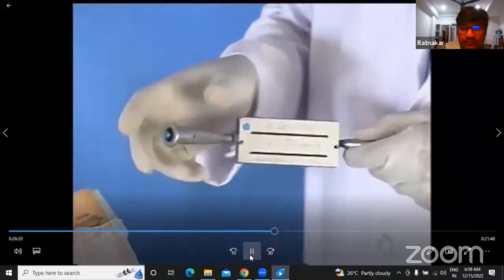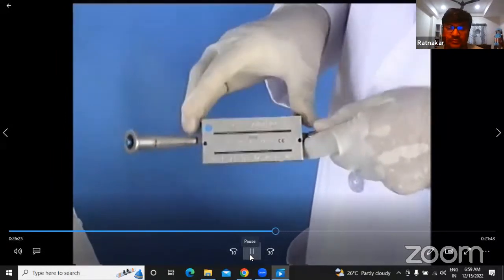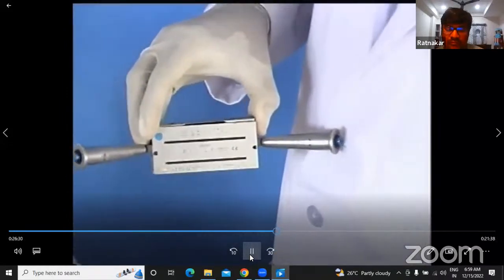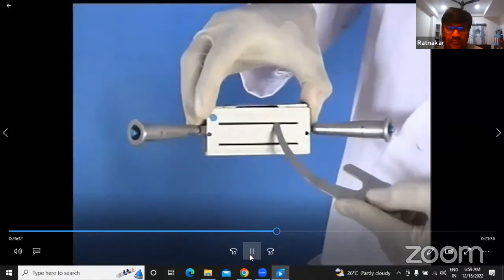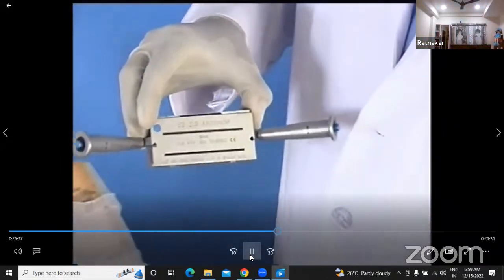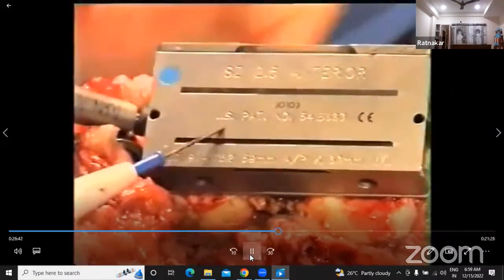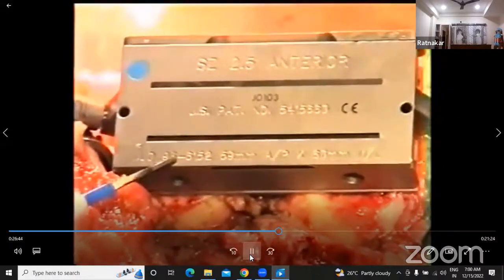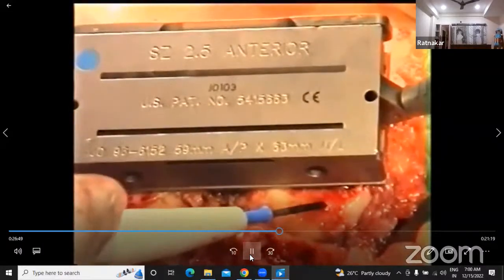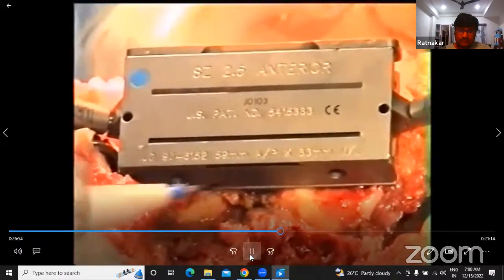This is a cutting device, whereby you can cut on the anterior side and cut on the posterior side, and you can do a chamfer there, and you can do a chamfer there. That means you finish all the other 4 cuts through this. Once you put this cutting guide, you should cross check whether your external rotation is correct or not. If your 3 degrees external rotation is correct, you will be ending up cutting more of the medial femoral condyle here than the lateral femoral condyle.